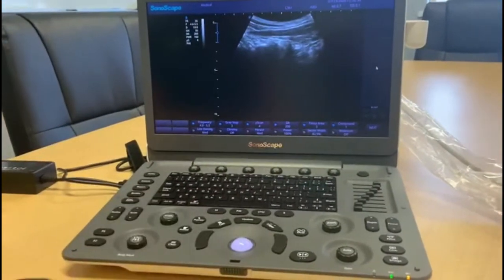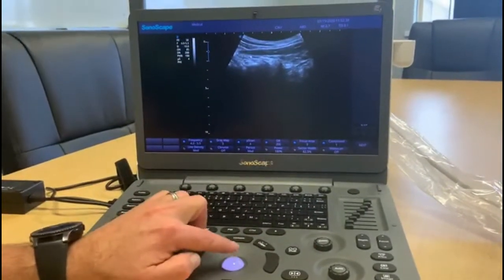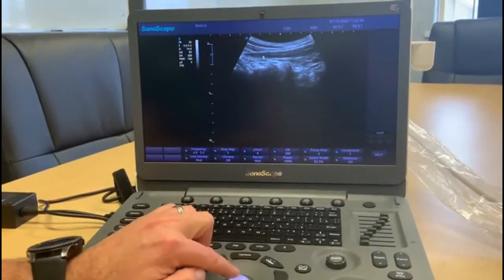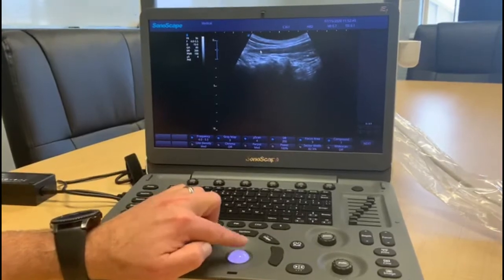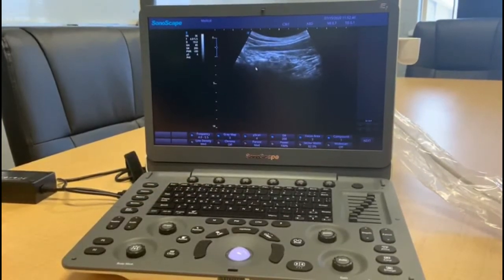The pointer will allow us to highlight to patients what we're looking at, rather than using fingers. That's a nice easy way to show patients what they are in fact looking at.